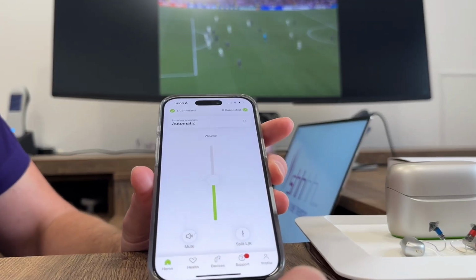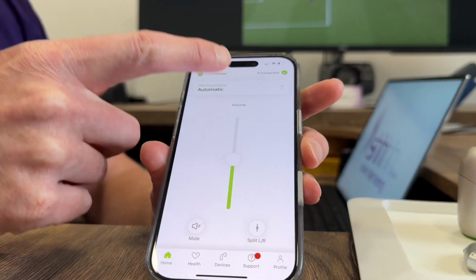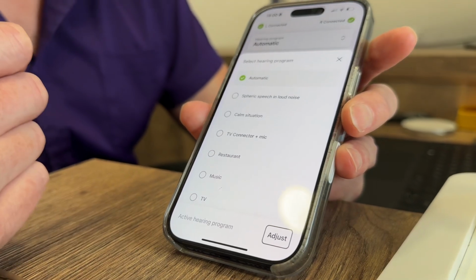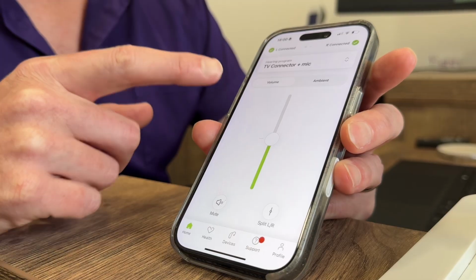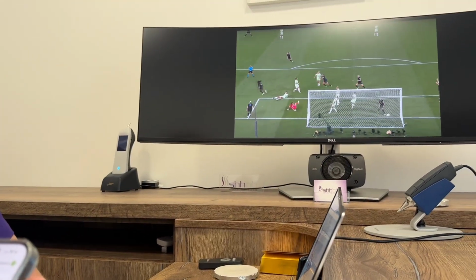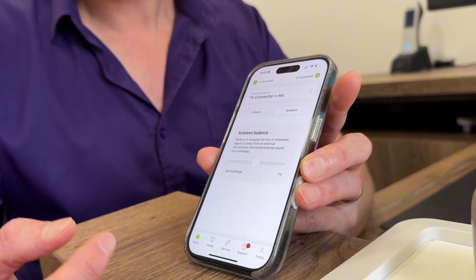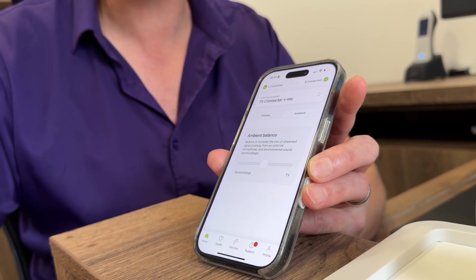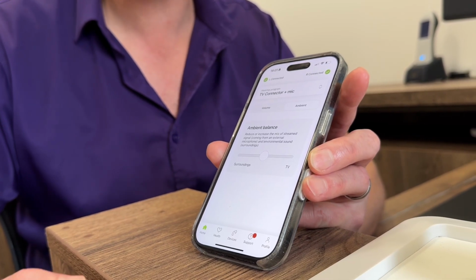Using your My Phonak app, you're by default going to be in the automatic program. If you click onto automatic, you will then have an option that comes up when your TV is on and in range for TV connector plus mic. Click onto that, and all of a sudden the TV is going to be streaming directly into your hearing aids. So by default, it will be set up that you're hearing through the TV and through your hearing aids. So if someone comes to the door, your other half's talking to you, you're still going to be able to hear what's going on.